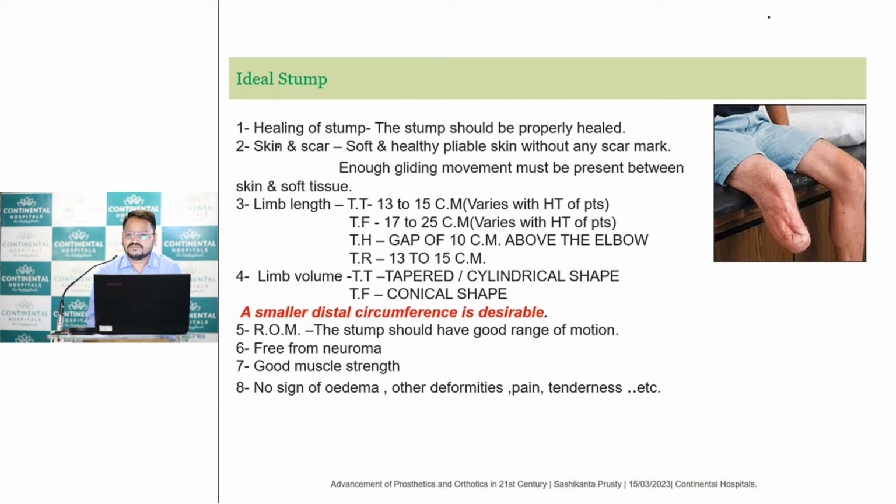We can control the muscle movement and we can use the patellar tendon. That can be the weight bearing area where we can put the weight of the prosthesis and the patient can walk on it. Or, if we see that the patellar tendon design is not suitable for patients with vascular conditions or diabetes, then we go with a total contact surface bearing socket design.